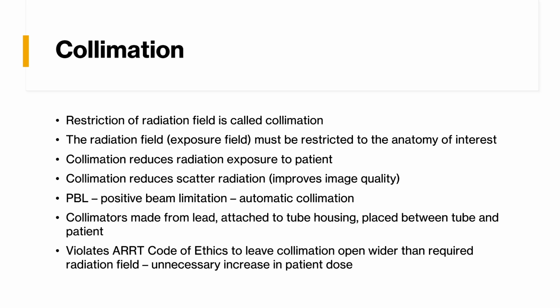So it's really important to make sure that you have that restricted to your anatomy of interest, because it violates your code of ethics via your licensing board to leave the collimator open wider than the required radiation field, because we're exposing the patient to more radiation, which could make their risk of cancer higher.